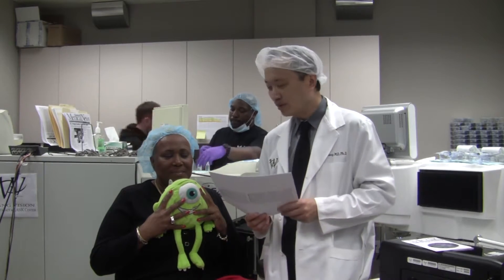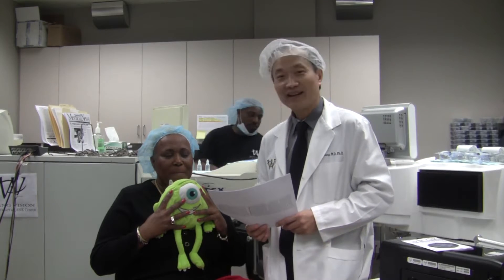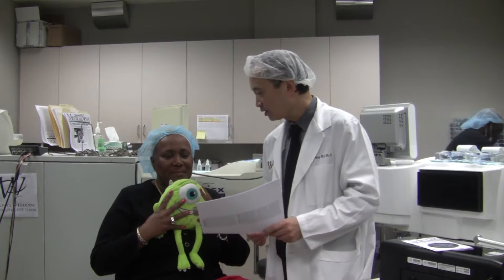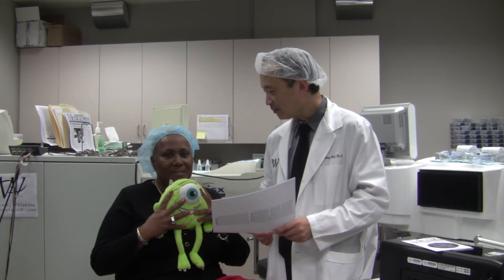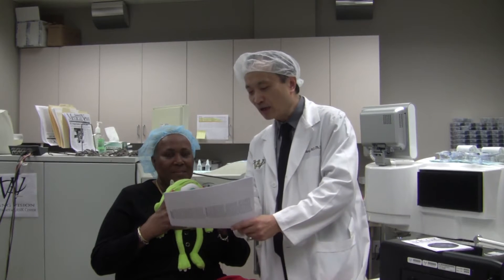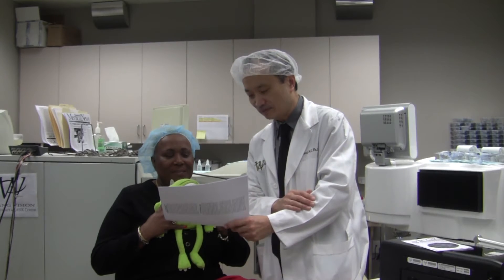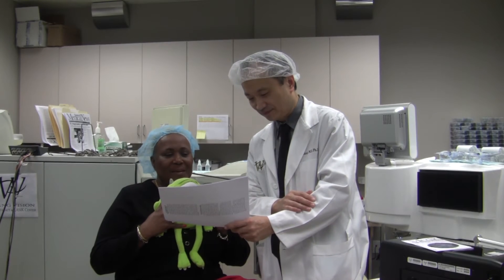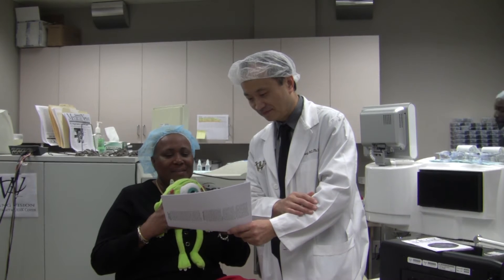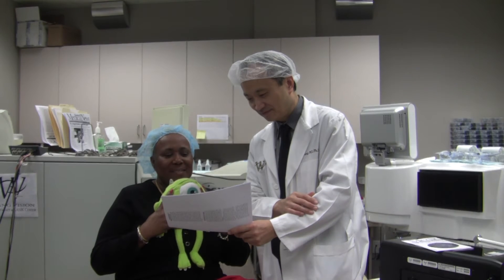Okay, here we go — exciting moment. Are you ready? Yes. Okay, 3, 2, 1 — go ahead and open. Okay, go ahead and read. Without reading glasses, read it out. Read: 'Image guided high definition LASIK.' Wow. Excellent. Congratulations, Dr. Pickstock!